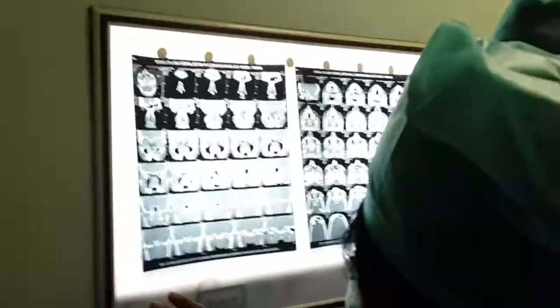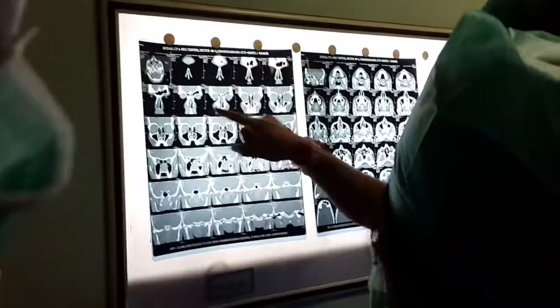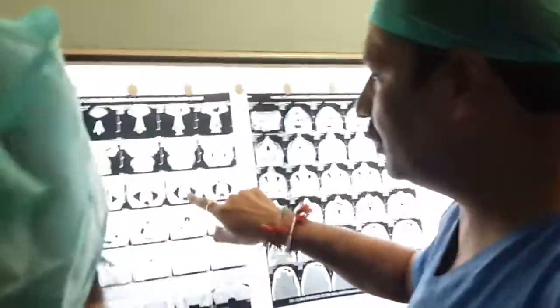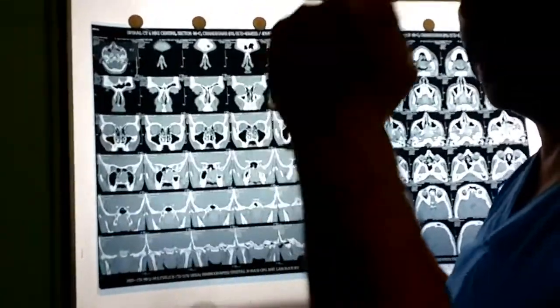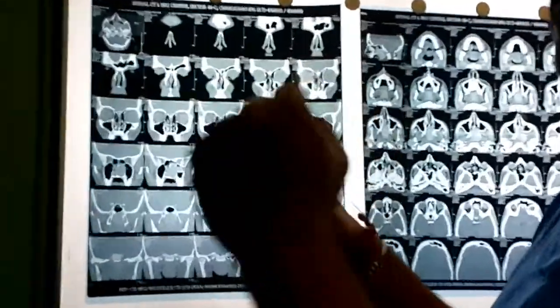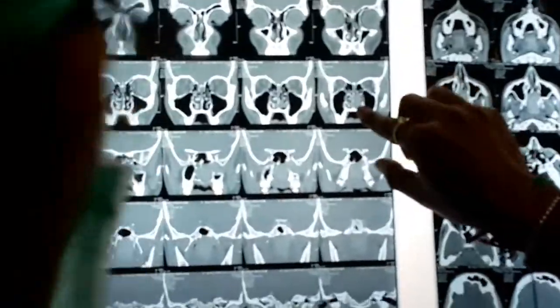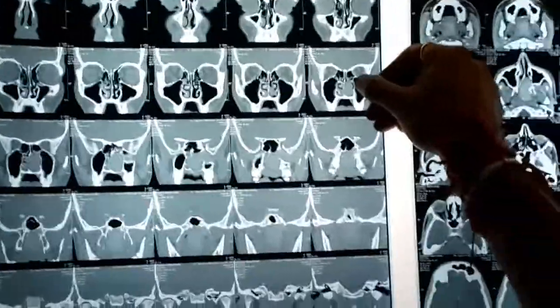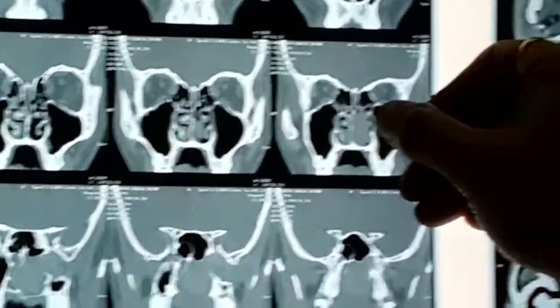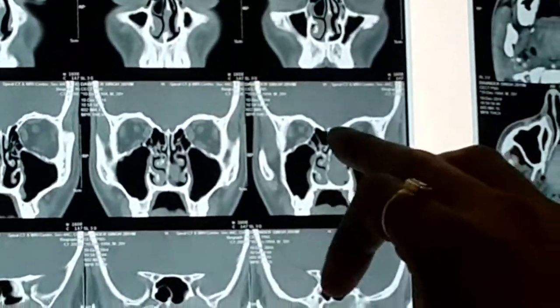Reading the scan from sinusitis — this is purely for the tumor purpose. To begin with, anteriorly in the nasal cavity, no tumor so far. The first appearance of the tumor is at this level. This gives you the idea that once you put the endoscope, where you are going to come across the tumor — this tumor you are going to find at the level of the perpendicular plate of the palatine bone.